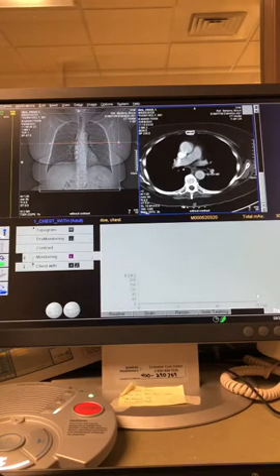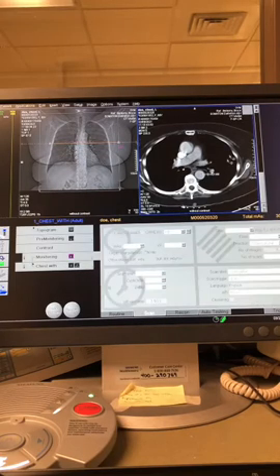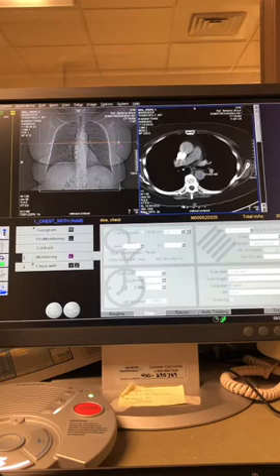Well, again, we had this last time. Anyway, this is set to trigger at 100. So when it hit 118 right here, it started the scan. So we've got 10-second delay, 1, 2, 3 images. We're at 13 seconds, okay?